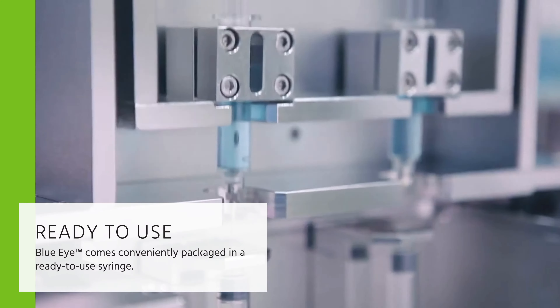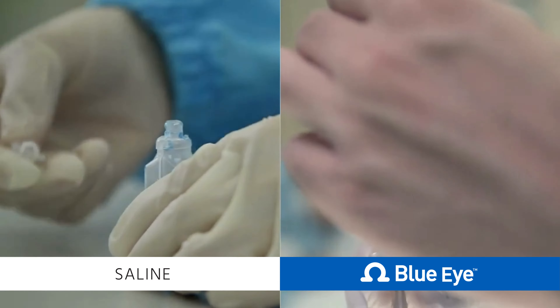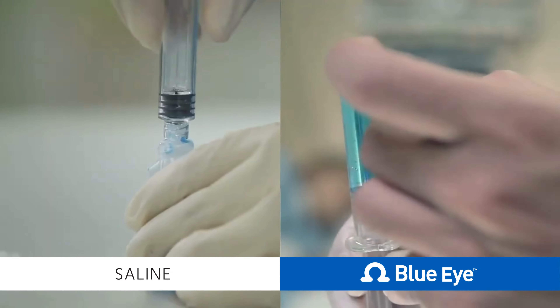BlueEye comes conveniently packaged in a ready-to-use syringe. You'll find BlueEye pre-mixed with a safety screw cap and traceability labels, making it incredibly easy to use.